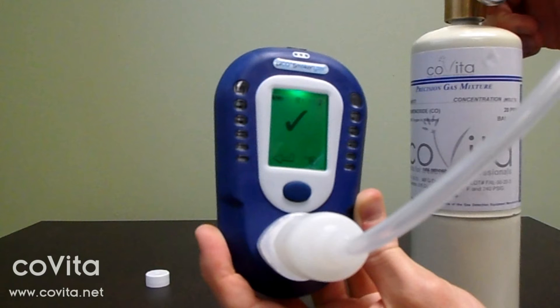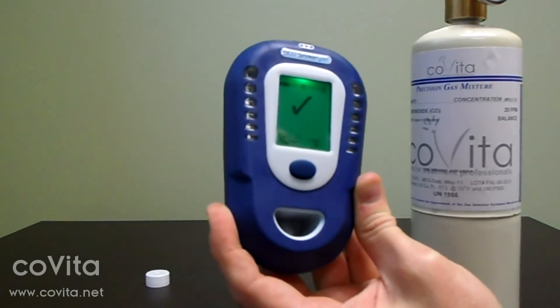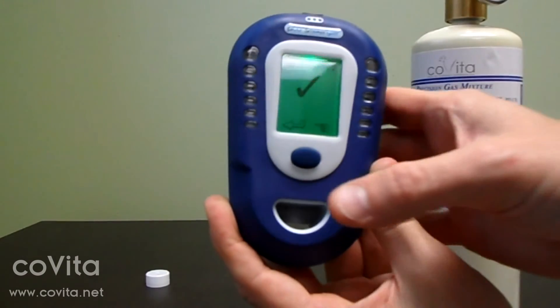If you receive an X on the screen, restart the calibration process. If you continually receive an X, call Covita for technical support. Next, remove the D piece. Double-click to respond to the check mark.